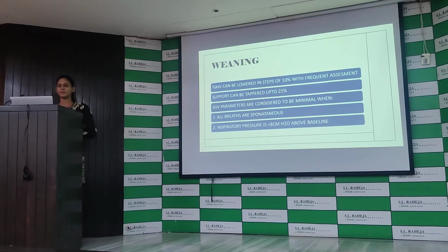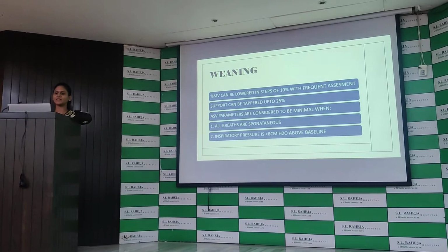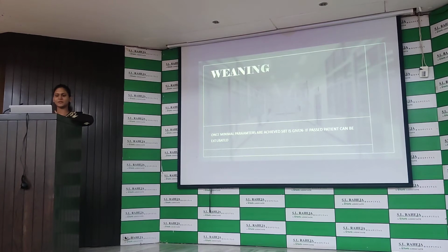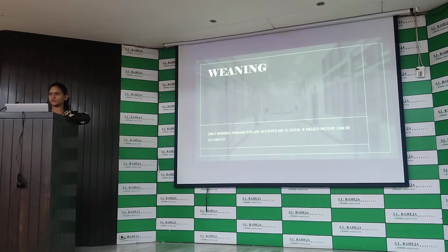Now the ASV parameters are considered to be minimal when all breaths are spontaneous and the inspiratory pressure is less than 8 cm above the baseline. Once the minimal parameters are achieved, it keeps on giving the SBT, and then we can extubate the patient accordingly. You understand, no?